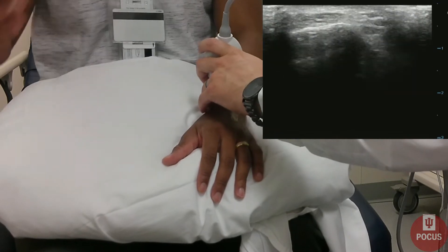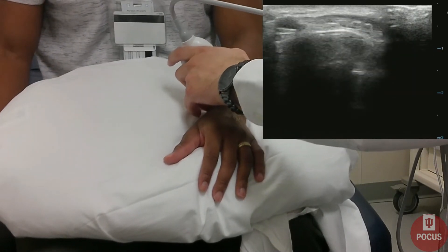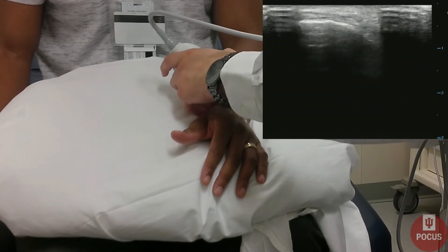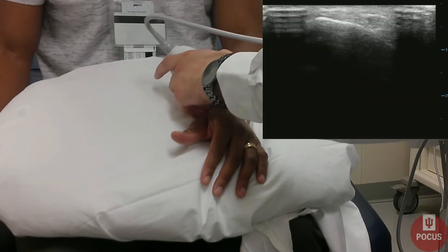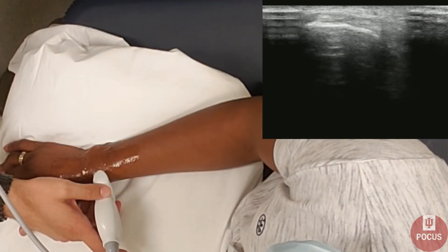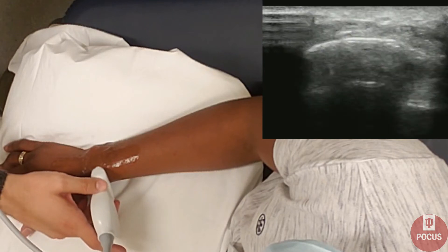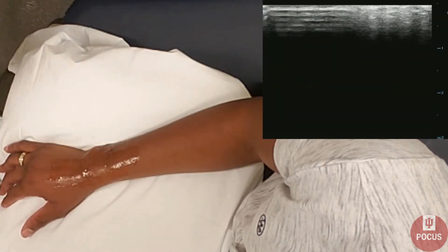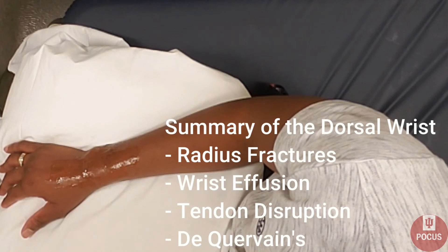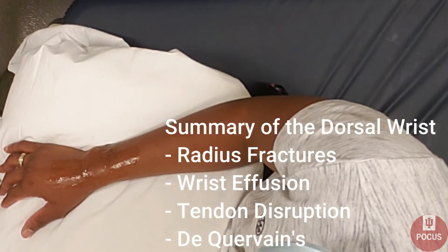Next, we will evaluate the radial side of the wrist, looking at the first dorsal compartment. This is the site of De Quervain's tenosynovitis. We can look at both tendons for any signs of anechoic black fluid, which would be a sign of synovitis. That concludes the summary of the dorsal wrist evaluation.